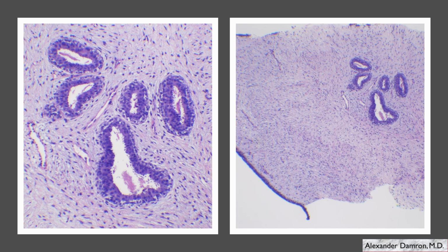So let's progress up on the continuum just a little bit, and let's take a look at this lesion here. What we notice here is that, again, the glands are open. Look, it's a little bit hyperplastic, but you have a nice benign myoepithelial cell layer, clearly benign ducts, glandular component. And if you look at the stroma, it's a little bit gray, right? It's a little bit myxoid, and it seems to be a little bit more cellular than on our previous case.